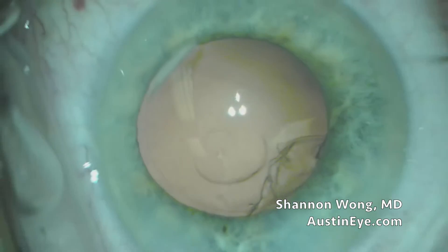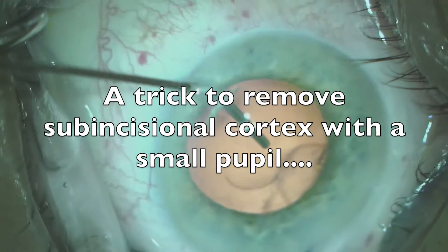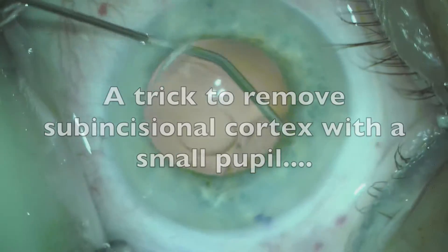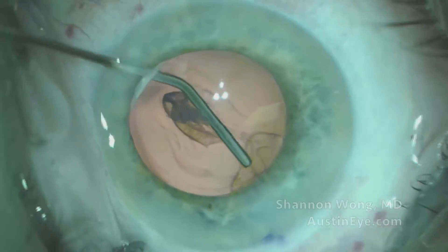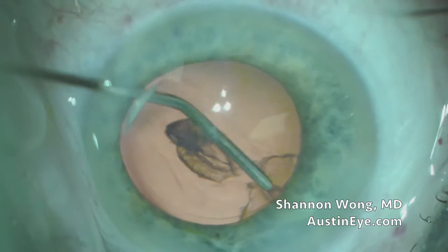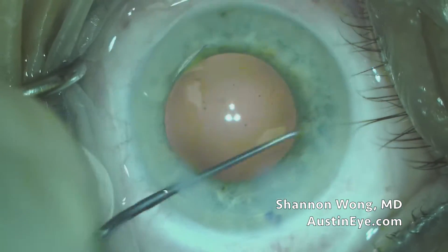We're having some difficulty removing sub-incisional cortex, so a trick is to make an opening 180 degrees away from the sub-incisional cortex, and then use a 27-gauge cannula on a BSS syringe and just aspirate the cortex out gently. The bag is filled with viscoelastic when we do this, so the risk is very, very low.